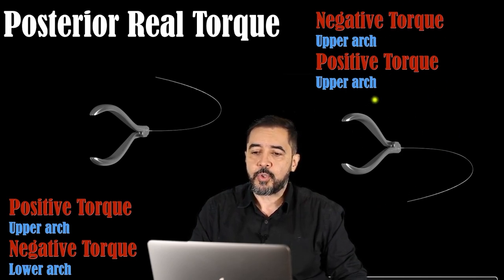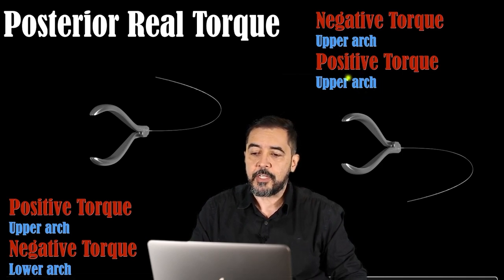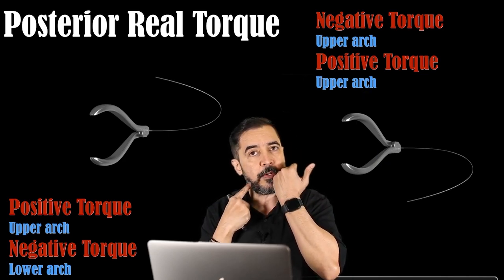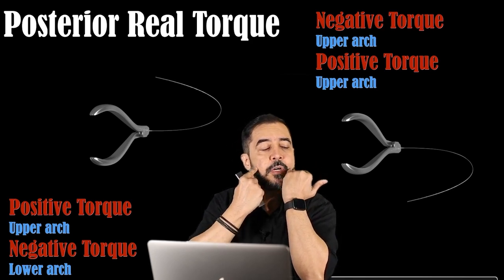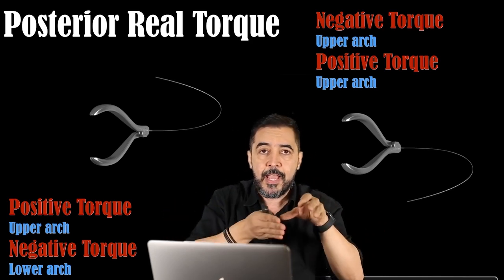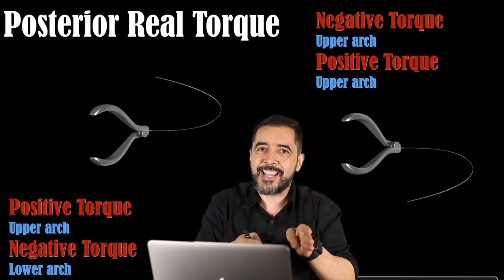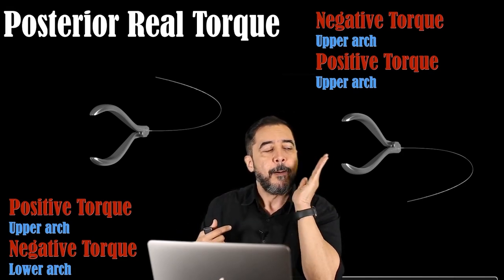The opposite to that, here is the lower arch, I'm sorry. If I'm putting this here in the lower arch like this, it goes down in the opposite tip of the arch wire, and we go horizontal, we apply a torsion, we apply a couple, which is going to generate a tendency of inclining those crowns buccally.